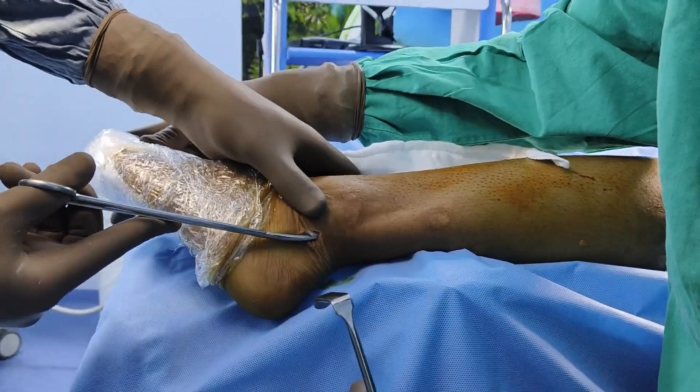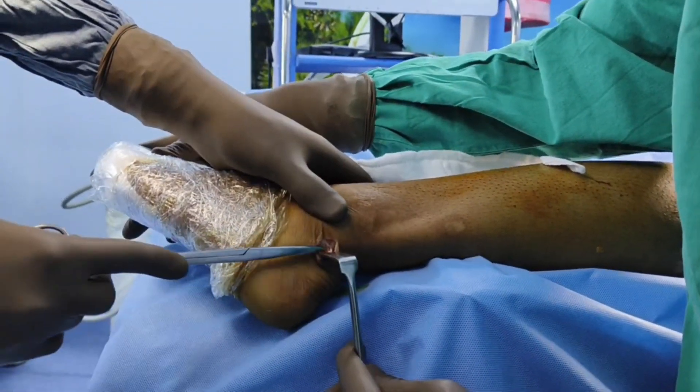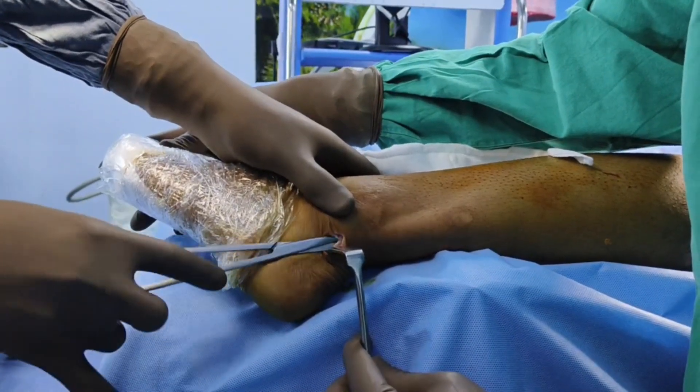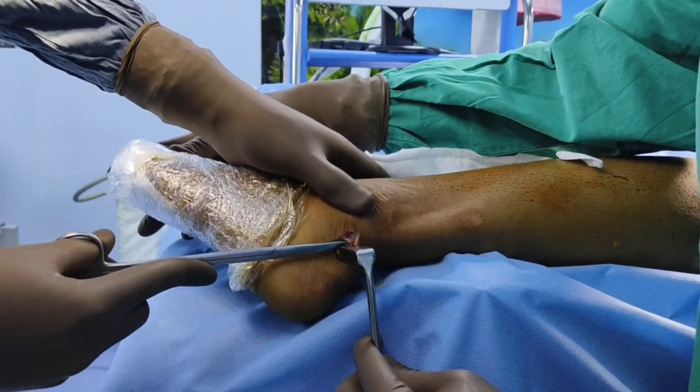This white structure is the peroneal retinaculum. When you cut this peroneal retinaculum, you will be able to see the tendons just underneath it.